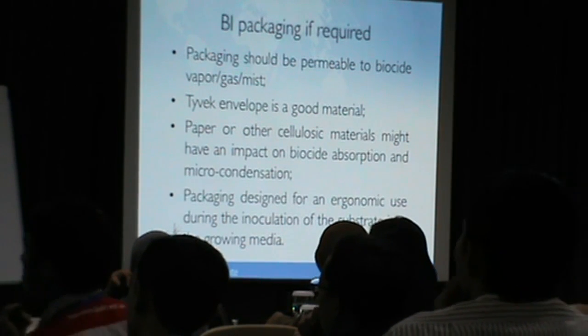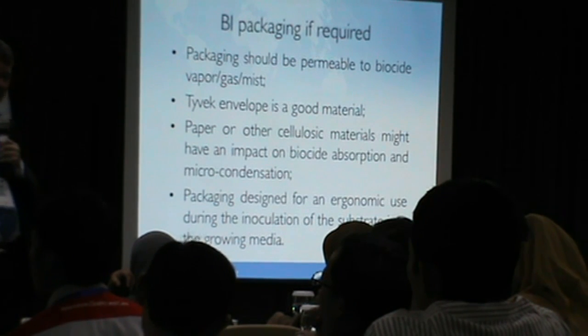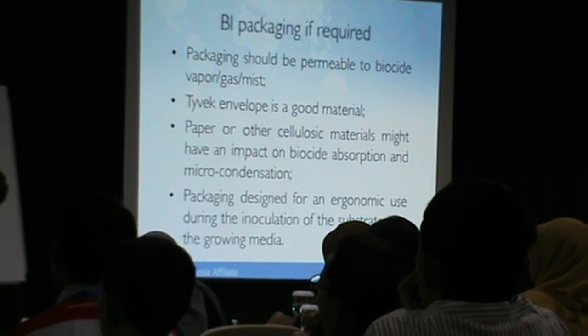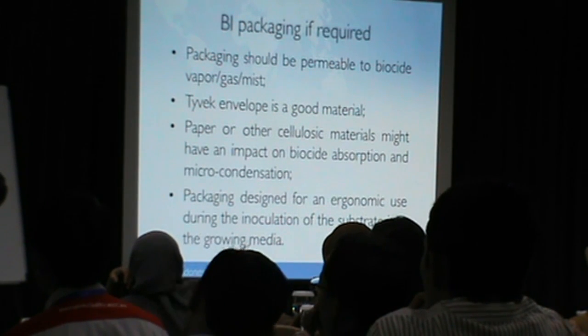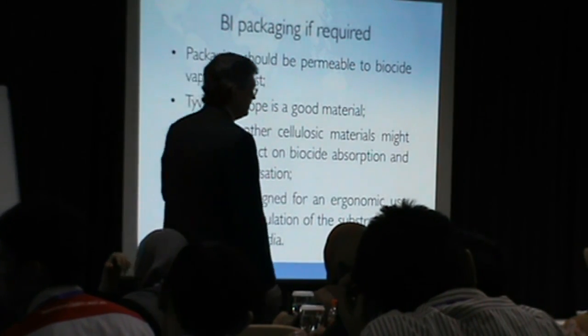What is it? Anyone remember? Getting rid of aeration out of this material. Tyvek package.